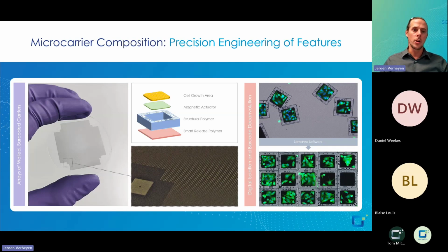And then the top interface of these materials, essentially what the cells see, is an inert gold layer, which we can attach with a variety of different cell attachment polymers. For example, fibronectin mimetic materials or straight up fibronectin, PDL, these kinds of materials.